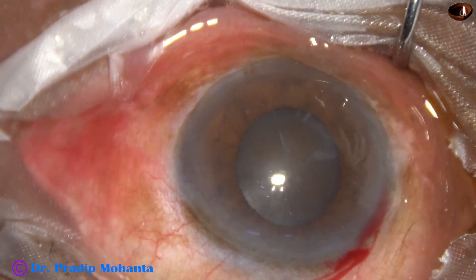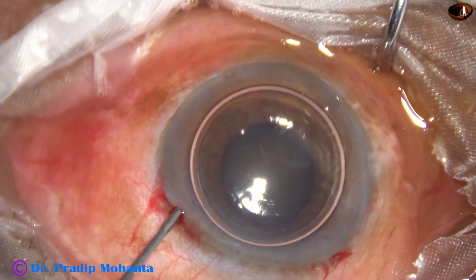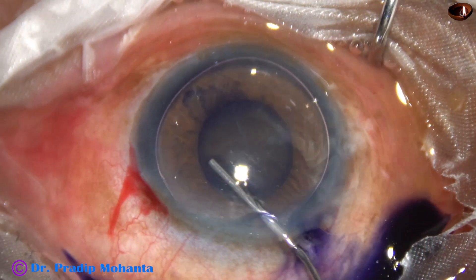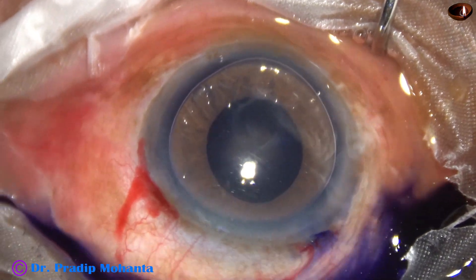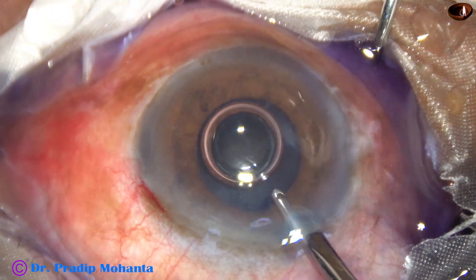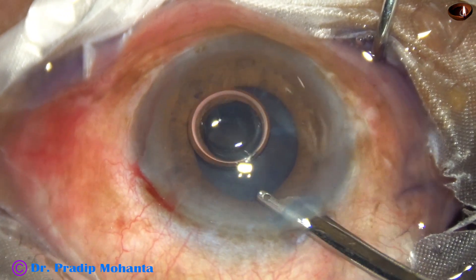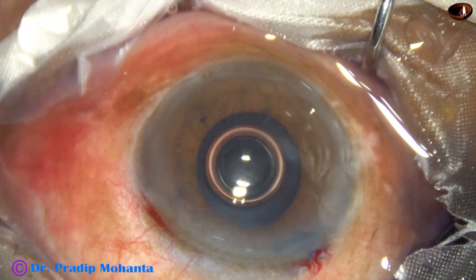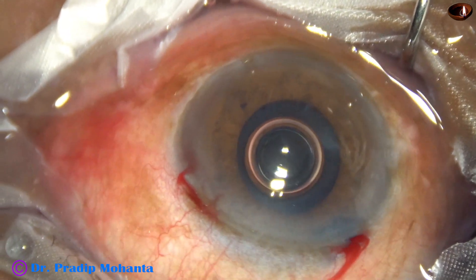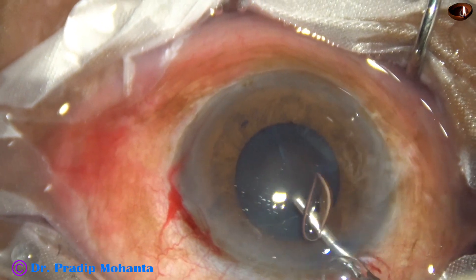The main incision has been placed. This is a side port on the left side of the main incision. An air bubble is injected into the anterior chamber and then trypan blue dye is applied to stain the anterior capsule. A bit of dye is applied under the iris so that all parts of the anterior capsule get stained. The dye is washed out to get a uniform anterior chamber, and now 2% hydroxypropyl methylcellulose is used to fill the anterior chamber.